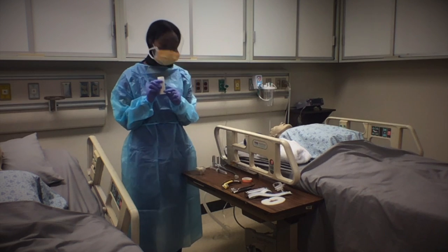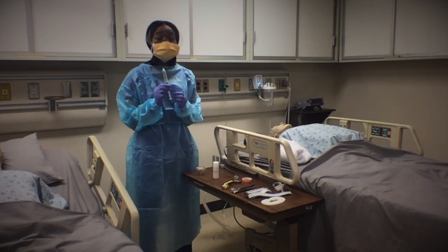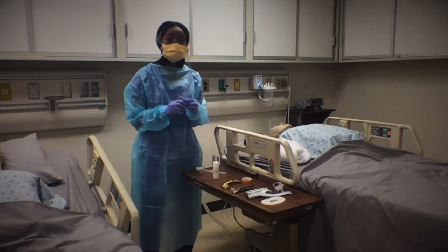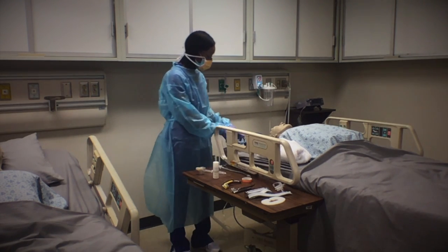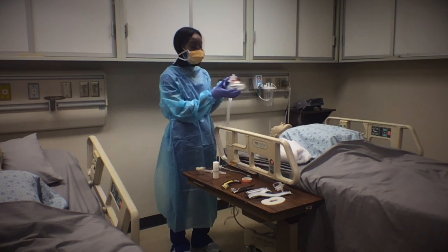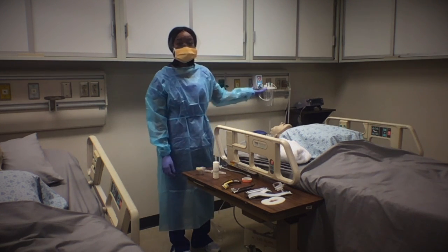I have my lubricant, my 10 milliliter syringe. I have the ET tube with the stylet. I have my stethoscope. I have the bag valve mask hooked up with the mask. And I also have my suction equipment hooked up.